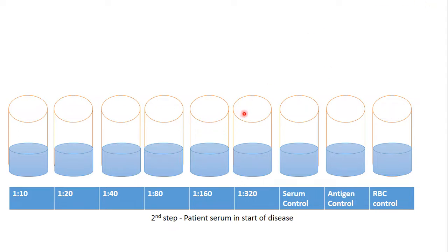Remove the last half of liquid into the disinfection solution. We add patient serum at the original dilution into the serum control, excluding the antigen control and RBC control.